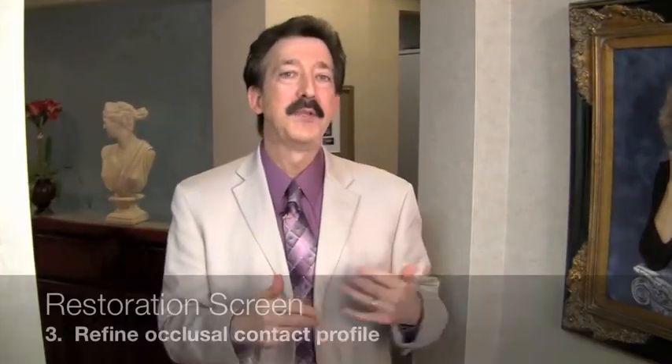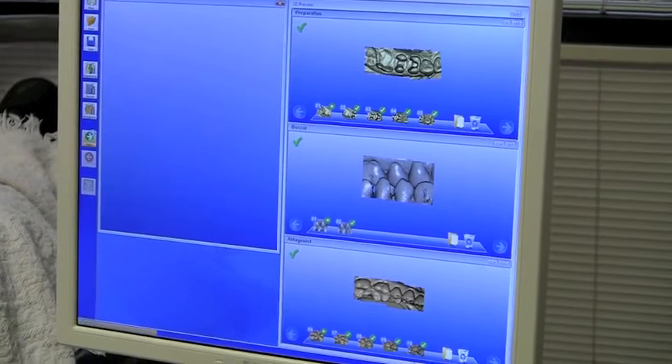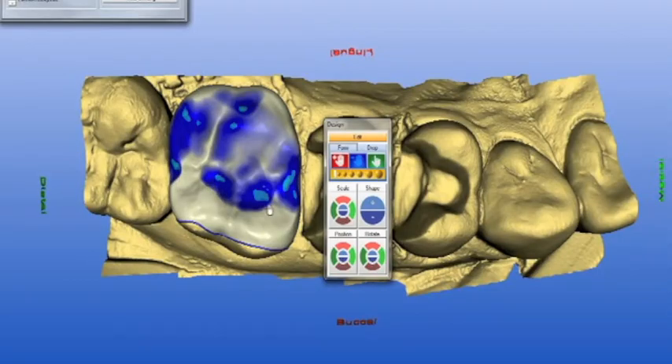Number three within your restoration screen is to set and finalize your occlusal contact strength. With the biogeneric, there's not a lot to do here, because the biogeneric software — when you're using the buccal scan and have the full opposing arch — the cusps will reach for the opposing arch and pretty much place those contacts where you want them. If I'm designing the upper, the cusp is going to reach down to the lower fossa and also the marginal ridges.